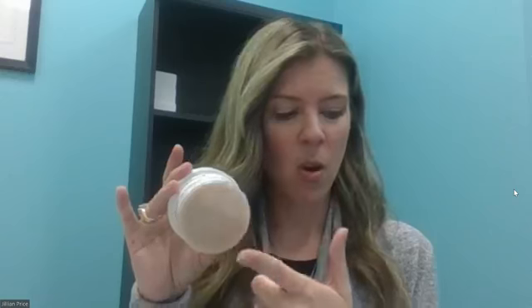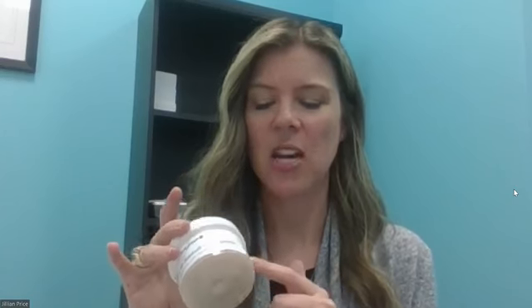Either you just discard this, what we call a puck, because they're in like a puck, and replace it with a brand new one, or we have versions of this that you can reactivate the beads by putting them in the microwave or oven. So you just have to refer to your user instructions to see what type you have. But this one in particular, I know for sure, you discard the puck and you replace it with a new one. There's no reactivation.